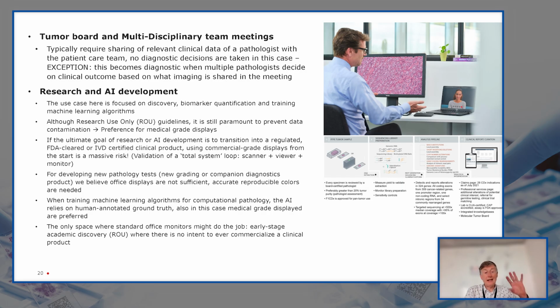Now looking at the other aspect, because there was a question also on tumor boards and multidisciplinary team meetings, there you typically only justify the decision you have made on your own desk or on your own display. So if you need to go to an MDT room where there's only an office display, it's perfectly fine to highlight and share a part of the imaging to say, this is why I took this decision.